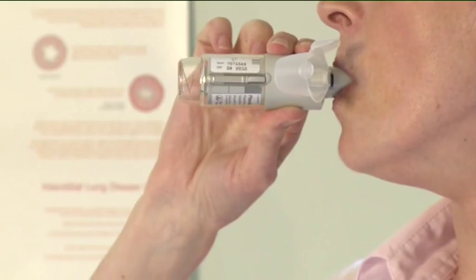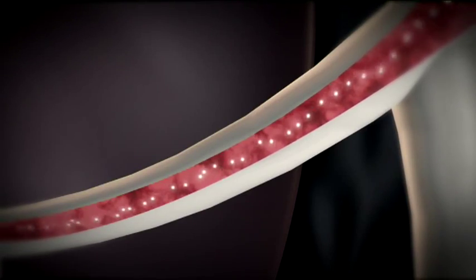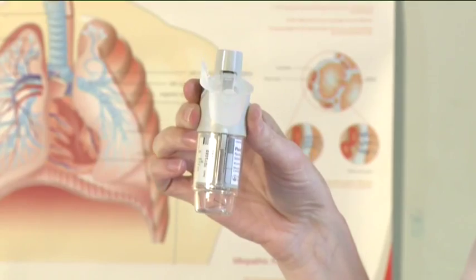While taking in a slow deep breath through your mouth, press the dark grey dose release button and continue to breathe in slowly for as long as you can. Hold your breath for 10 seconds or as long as is comfortable. Repeat the previous steps to take a second inhalation. Close the transparent cap until you use the Respimat inhaler again.